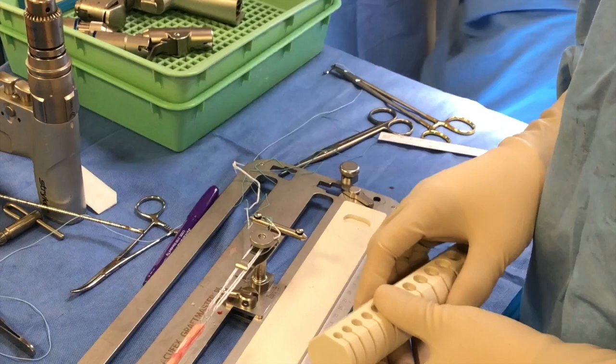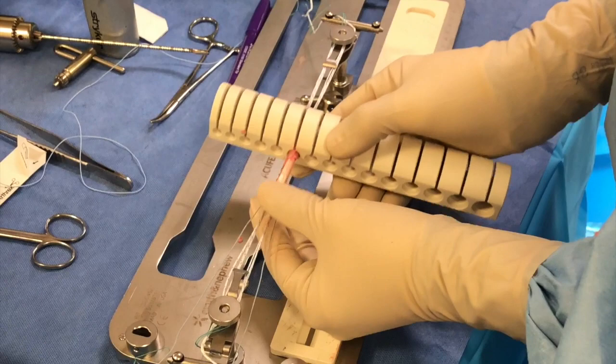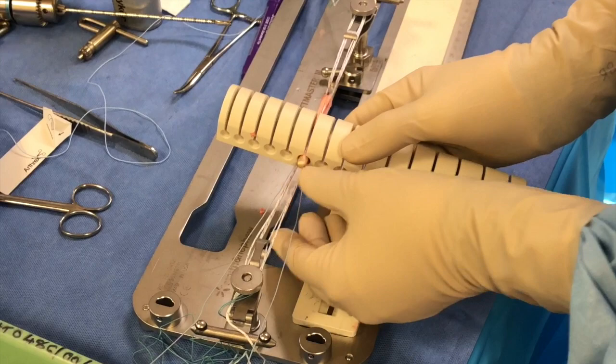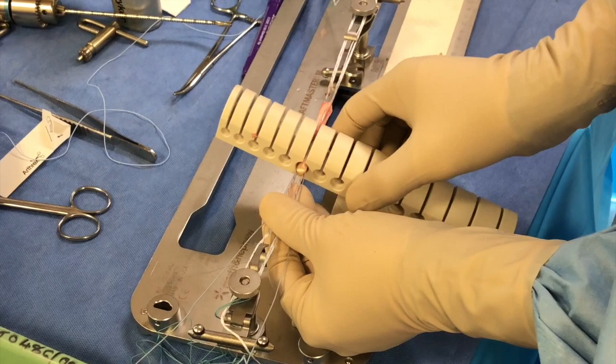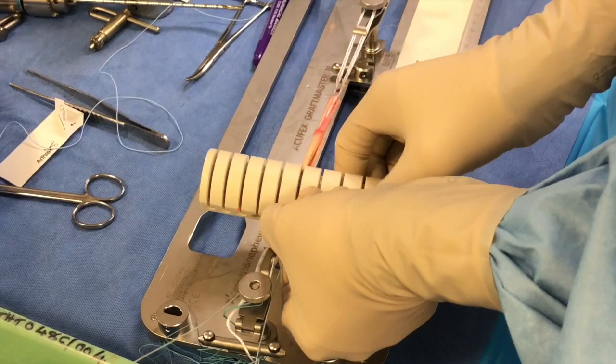The next step is to give an initial sizing of the graft. We use various different sizing templates and essentially just pass that over the graft — that's the femoral end without the tails, and that's the tibial end. As we pass it up through the tibial end, we need to make sure that the whole graft will be able to pass through. In this case it's tightest at the tibial end, so that will determine the size of our tibial tunnel — and in this case it's a 7.